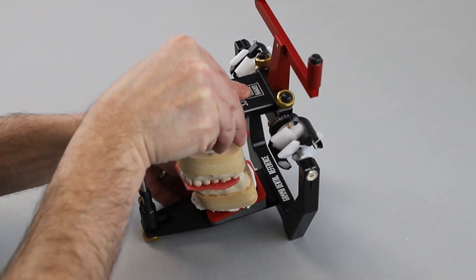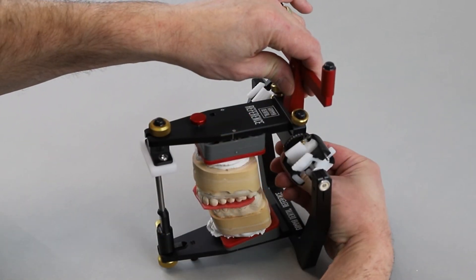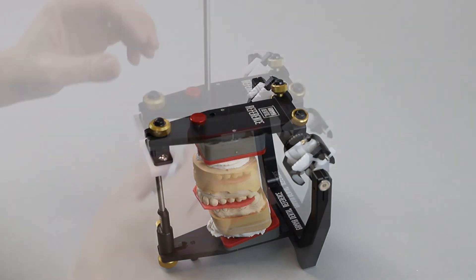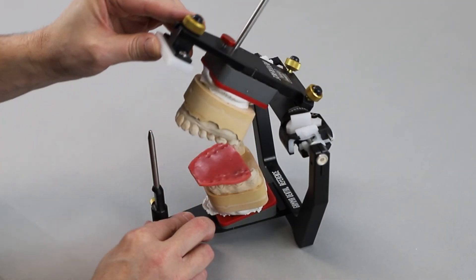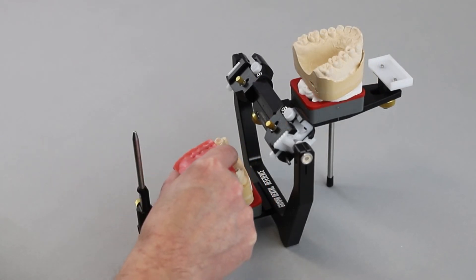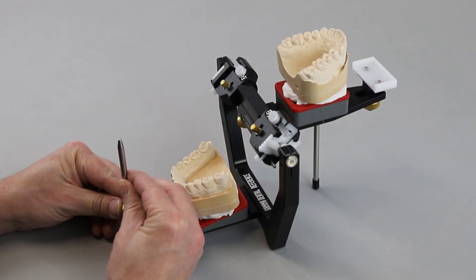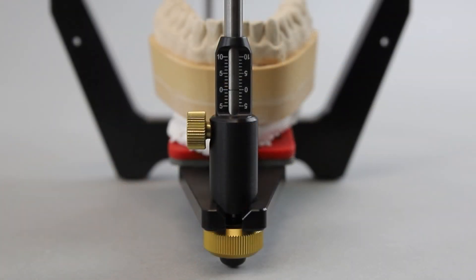Remove the mandible mounting clamp. Open the articulator and remove the bite registration. Set the incisal pin to zero and close the articulator.